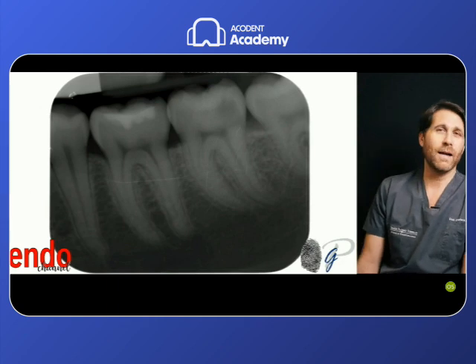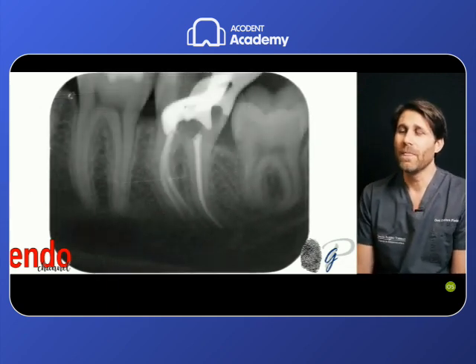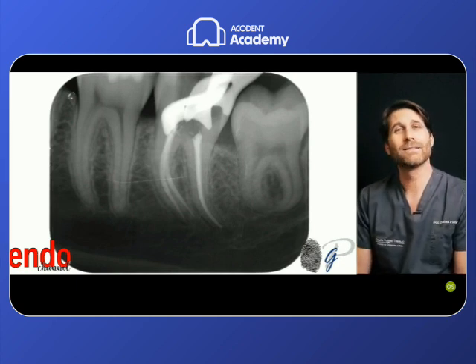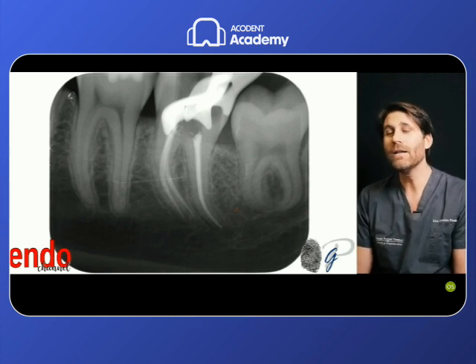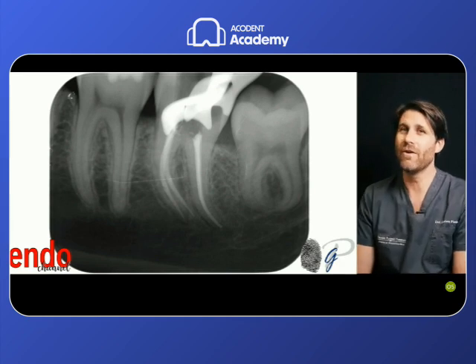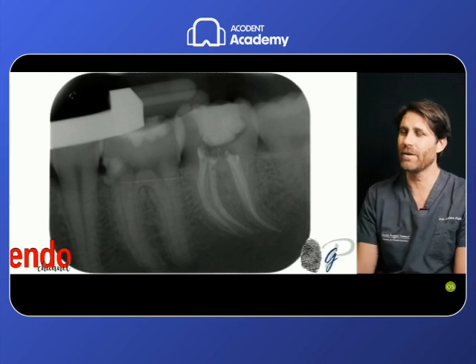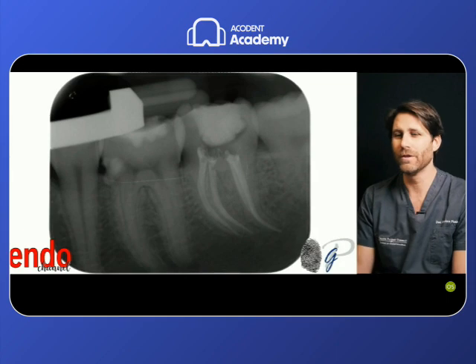And this is one explicative and simple case just to see the use of this instrument in these standard cases where we have a standard scoutable anatomical path, even if these root canals are very curved, but if they were initially scoutable with hand files, we can prepare with these instruments very easily, very fast and efficiently. And this is the final radiograph after the preparation with the two very curved mesial root canals, the two confluent, very curved distal root canals.